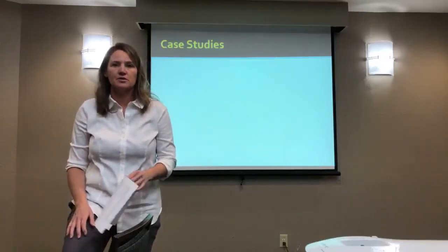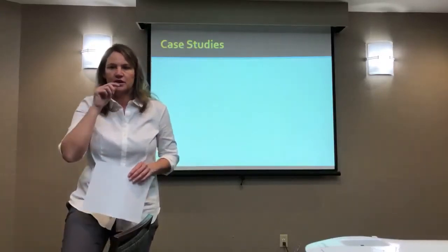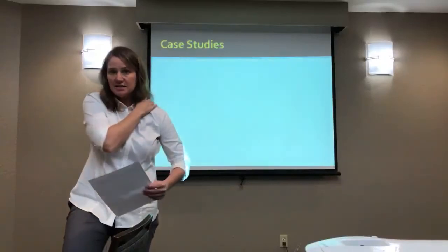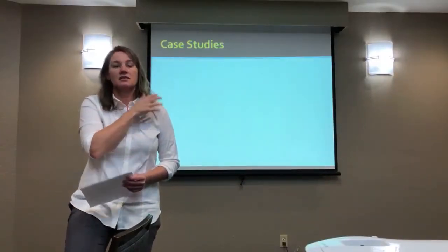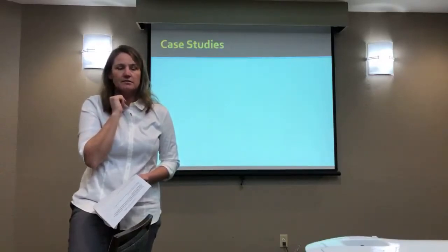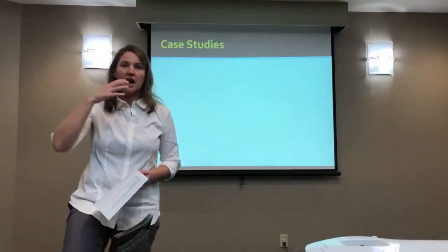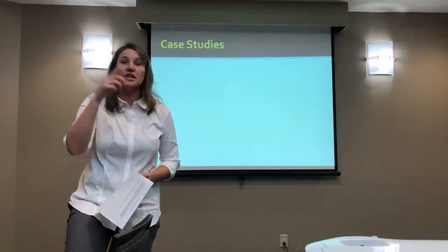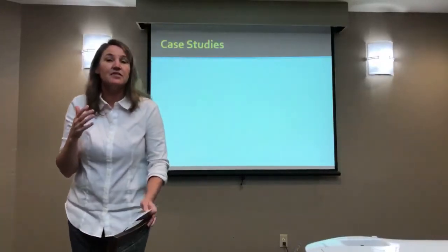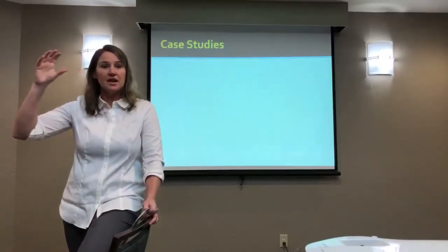Could you go higher than 1 watt per centimeter squared? Depending on the person. Exactly, it depends on the person. Even in this room, we could look around and say, I might go maybe 1.2 or 1.5 watts per centimeter squared on some other people. It could be the size of the area, the depth, their ability to communicate, how long it's been there, and your technique. If you tend to move over a bigger area, and I tend to move over a smaller area, I could be using lower intensities and getting the same outcomes as you with higher intensities. It has nothing to do with the number so much as how big an area we're trying to treat. So your own technique could make what appears to be a really high intensity not quite as high.